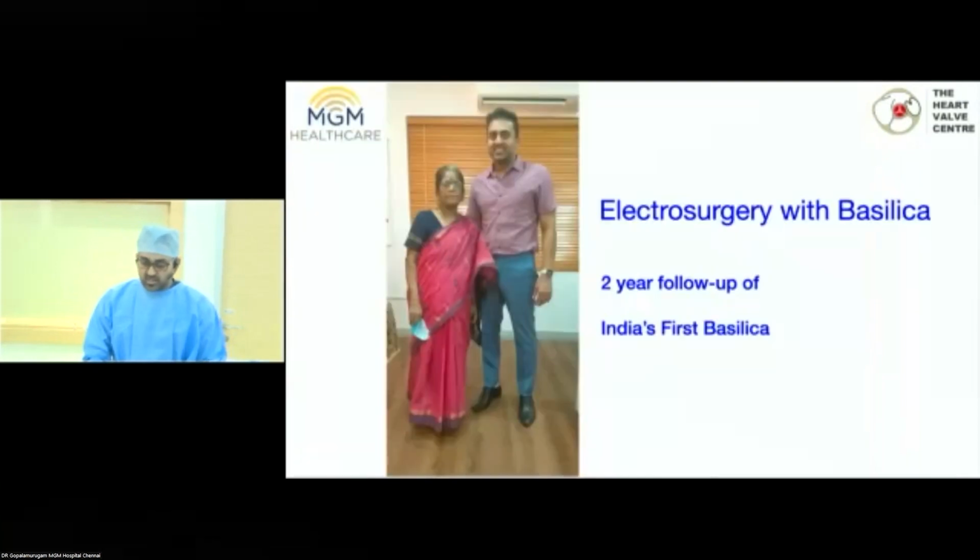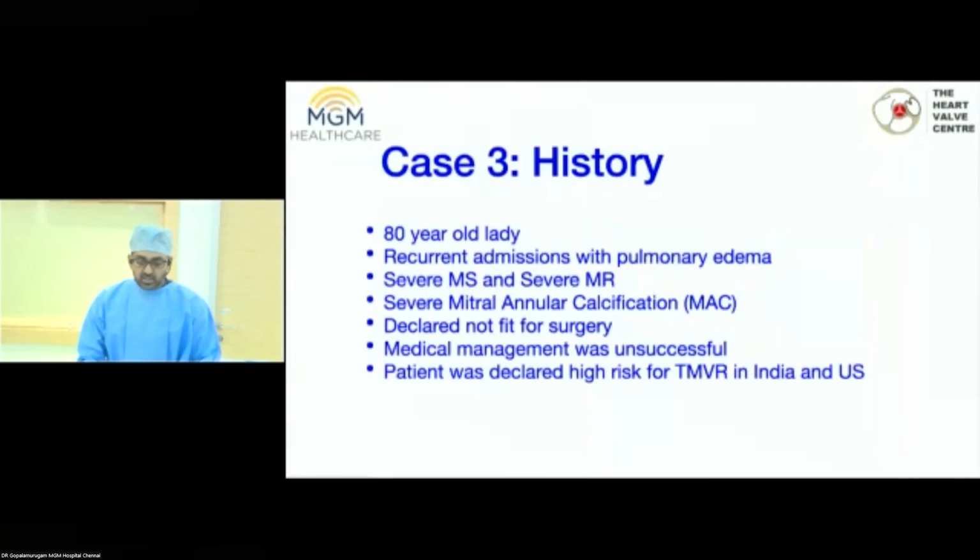And this is here electrosurgery with BASILICA, 2-year follow-up of India's first BASILICA. So they work with a very good follow-up. Third case and the last case.